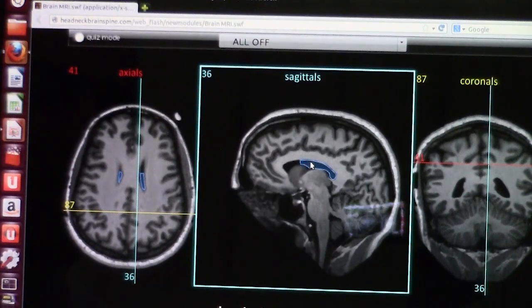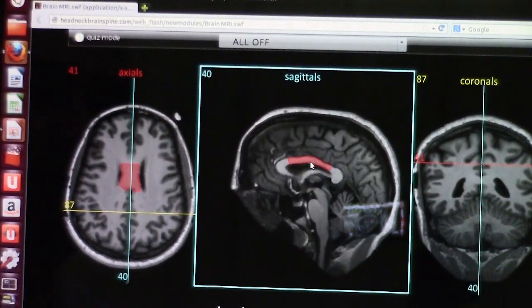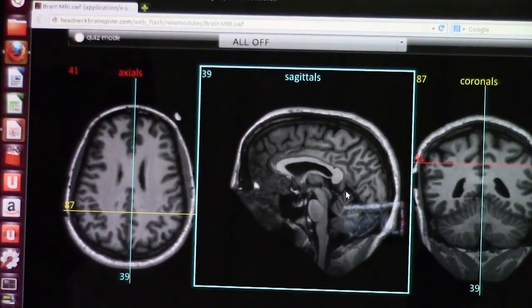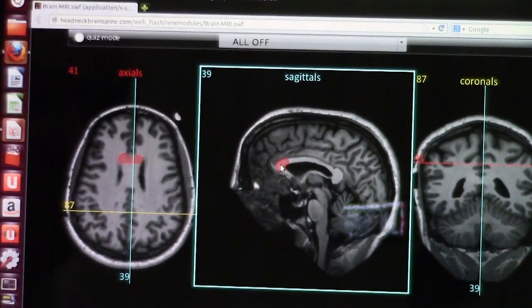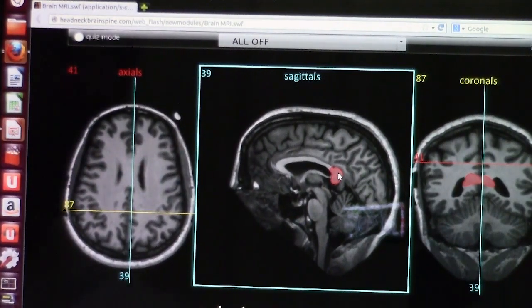Looking at the sagittal T1 cut — remember on T1, white matter looks white, gray matter looks gray or darker, fat looks white, and bone looks dark. The corpus callosum has four parts: the rostrum, the genu, the body, and the splenium of the corpus callosum. On sagittal T1, it is extremely important to look at the corpus callosum and all four structures.